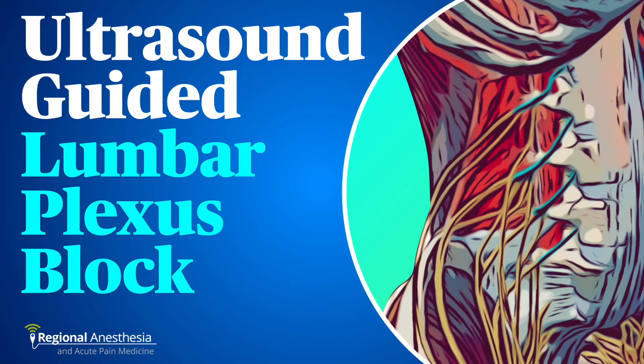The lumbar plexus block is an advanced regional technique that anesthetizes multiple nerves in the lower limb in one go. In this video, we'll discuss the anatomy, sonoanatomy, technique, and things to watch out for when performing an ultrasound-guided lumbar plexus block.